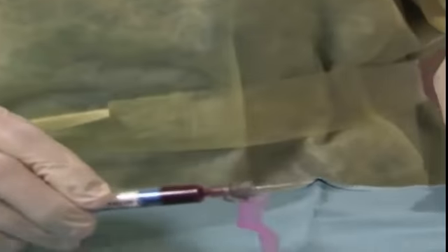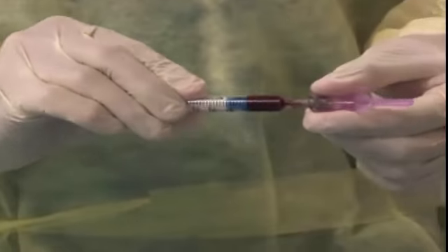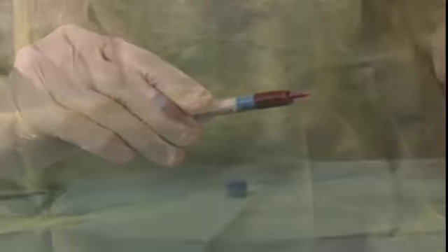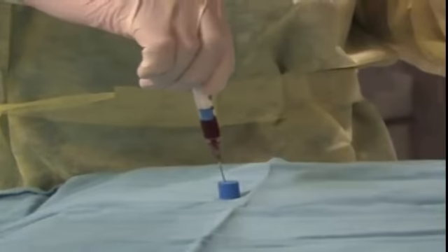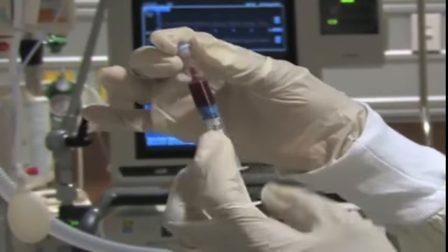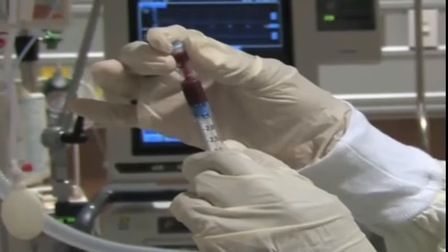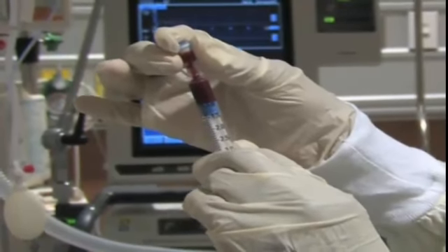In the meantime, expel the air bubbles from the syringe. Cover the needle with the attached safety cap and remove the needle from the syringe, or remove the needle from the syringe using the rubber stopper. Attach the heparin-containing cap and, while holding the cap in place, push the plunger of the syringe to ensure the blood encounters the heparin. This will prevent the blood from clotting.